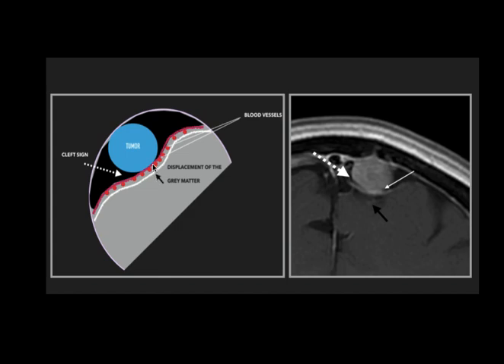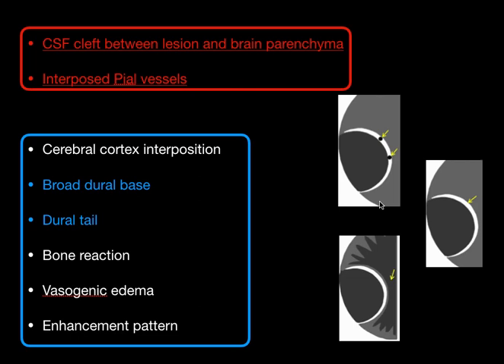The vessels lie between the tumor and the cortex. Here is a classic example of a meningioma — you can see the displaced cortex with pial vessels, and the cortex is buckled. The two most important signs are: the CSF cleft between the lesion and the brain parenchyma, and the interposed pial vessels. You can clearly appreciate the CSF cleft, also called the meniscus sign or CSF cleft sign, and you can see the pial vessels between the tumor and the adjacent cerebral cortex. This is the white matter buckling.